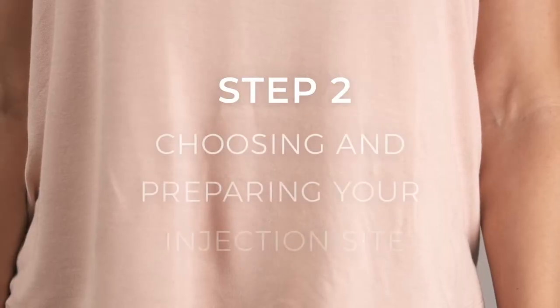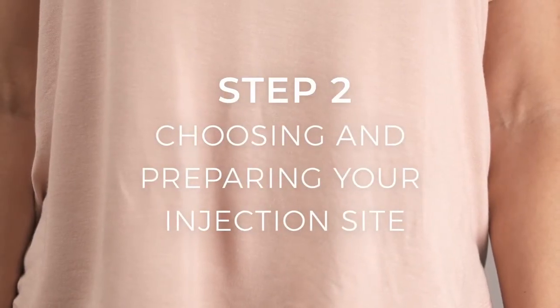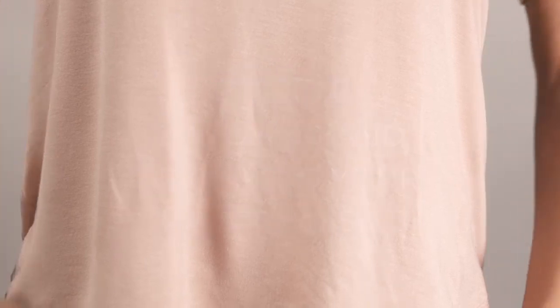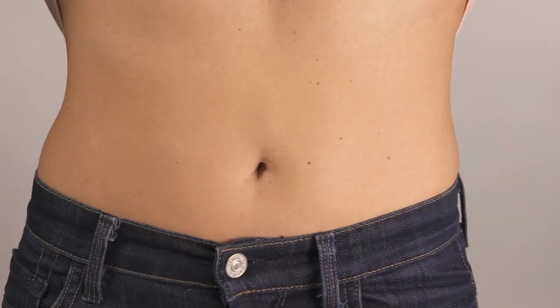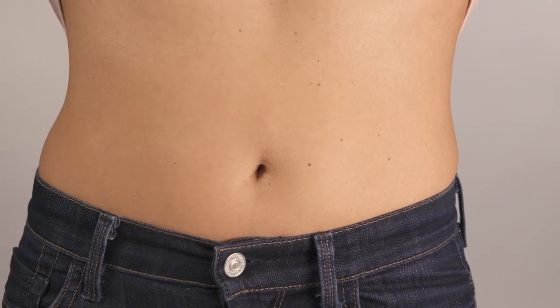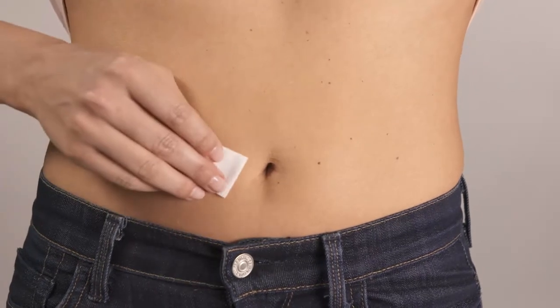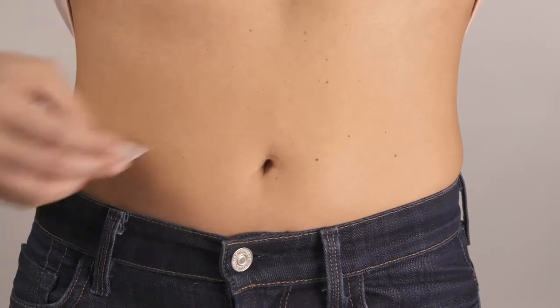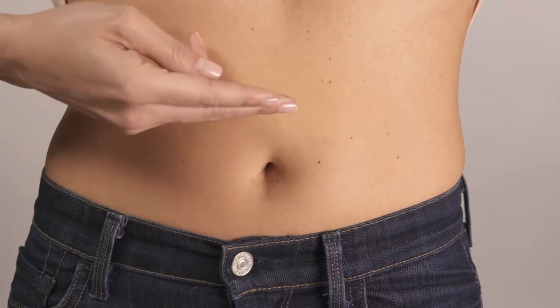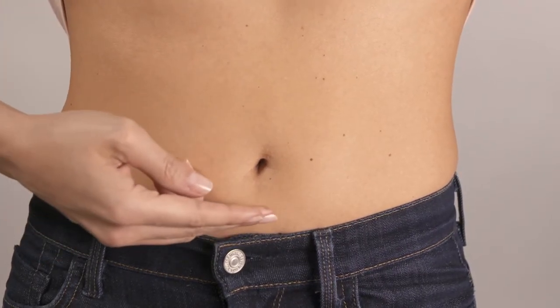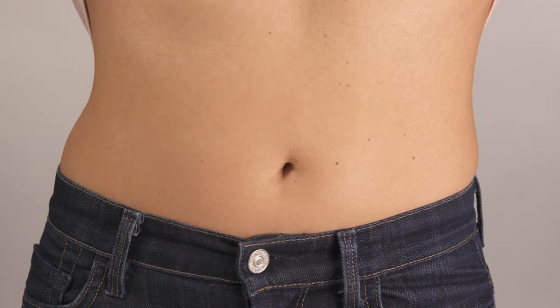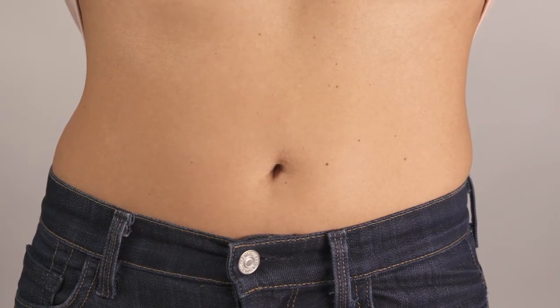On to step two, choosing and preparing your injection site. Select an area around your stomach for the injection, like your doctor or nurse showed you during your training, and wipe the skin with an alcohol pad to clean the site. A good tip is to choose a different injection site each time you give your injection. This will help to reduce potential redness, irritation, or other skin problems.